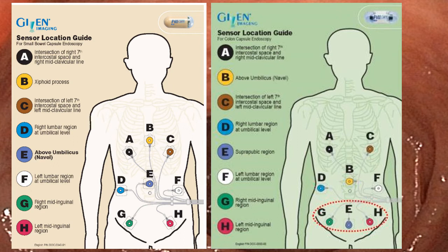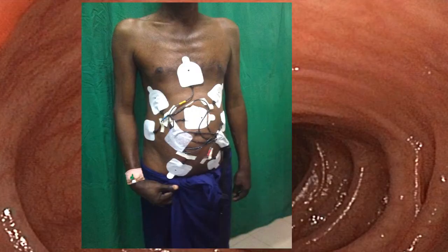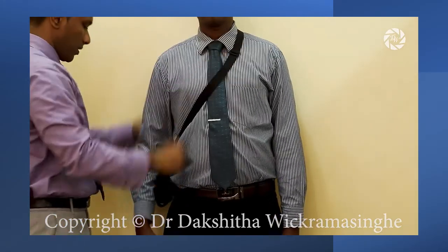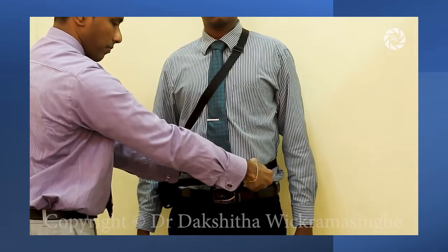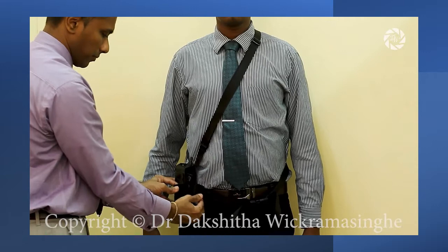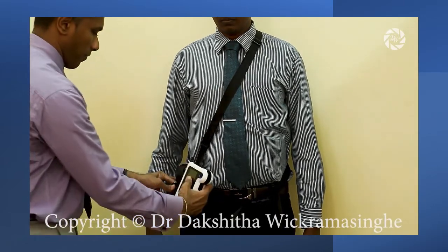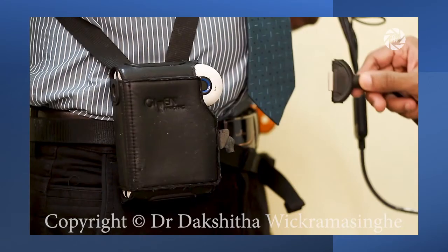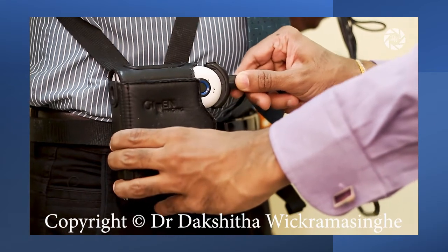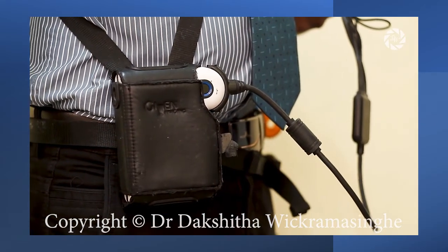Place the sensors on the patient's body according to the locations indicated in these images. This is how the sensors look when placed on a patient's body. Place the strap of the case over the left shoulder, then secure the belt around the waist. Finally, move the case to a convenient location and secure it by closing the Velcro flaps. To connect the sensor array to the receiver, orientate the arrow forward and connect it to the connector on the side of the receiver.